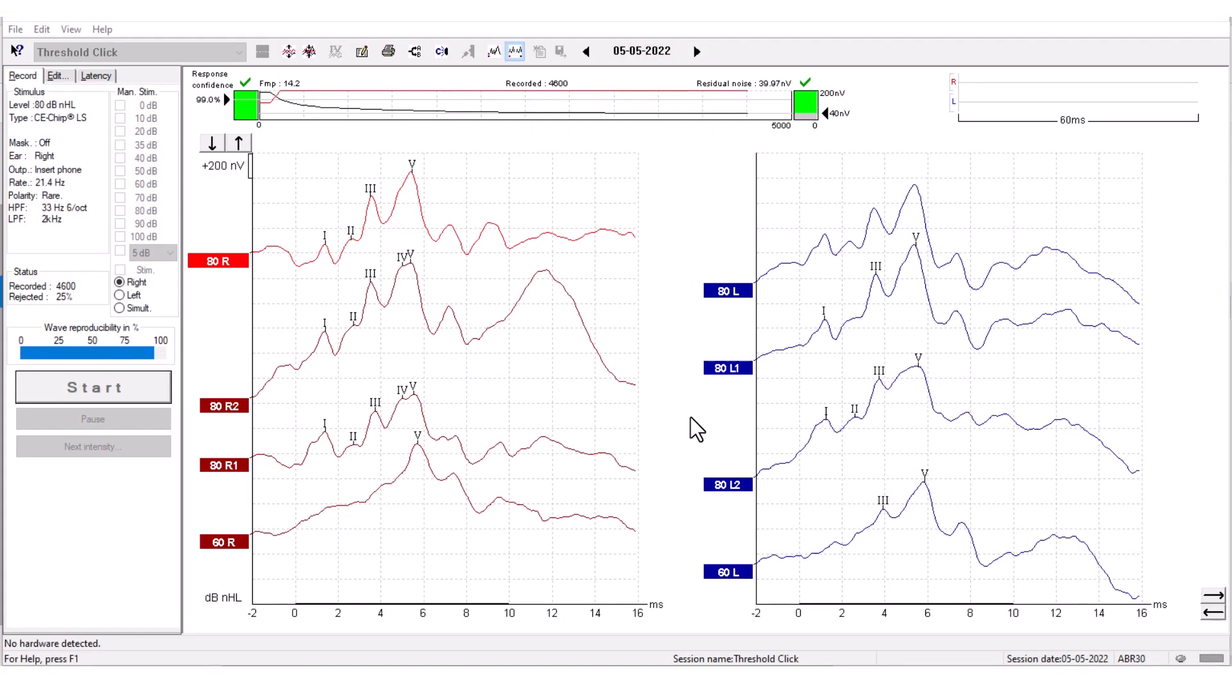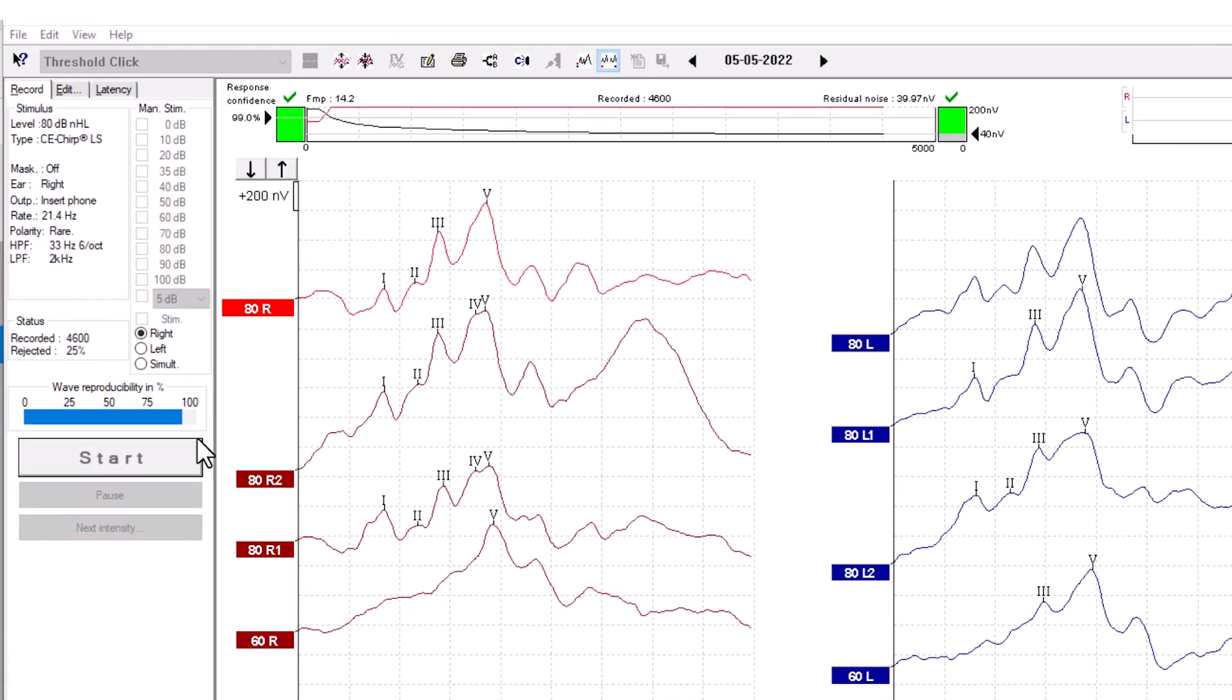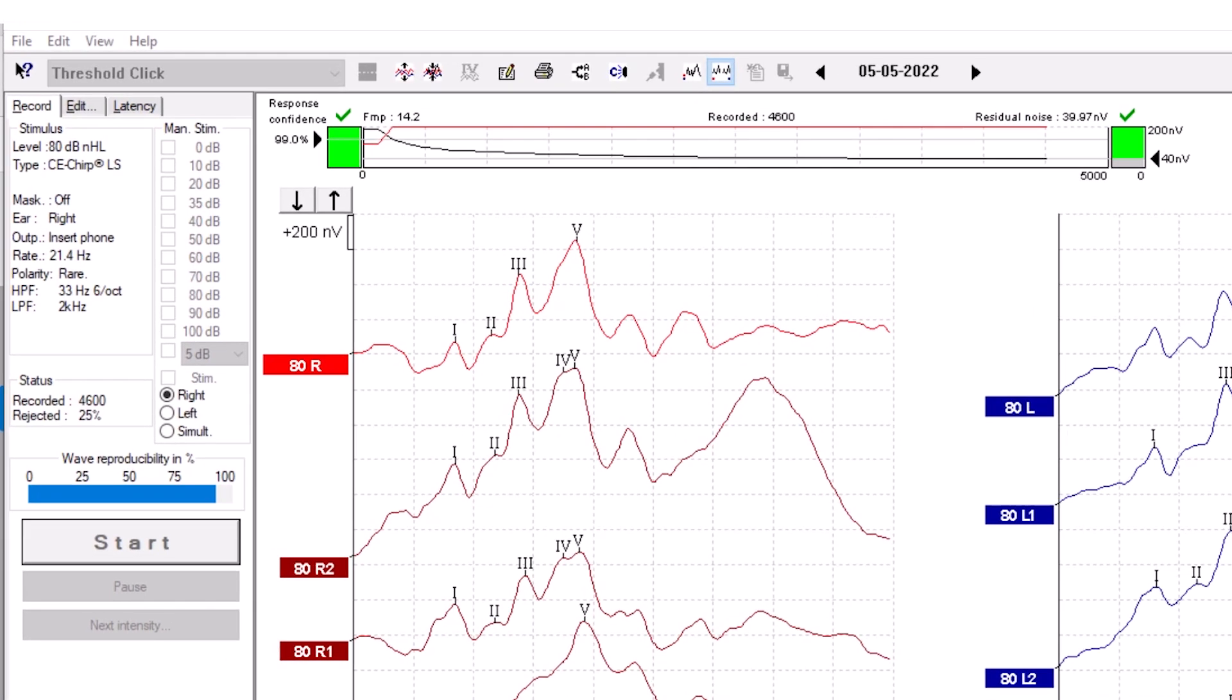How to use the recording tab. This is how to use the recording tab in the Eclipse software. This tab is the default tab. Now let's look at the recording parameters.